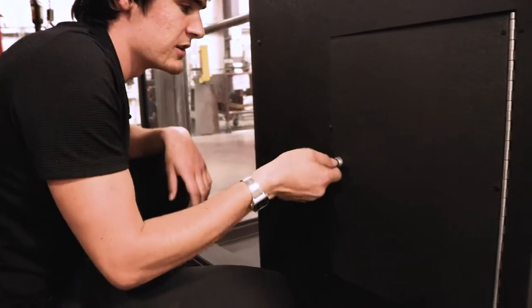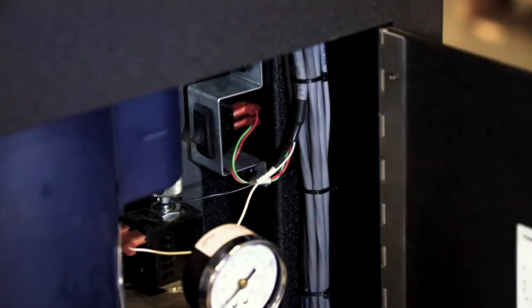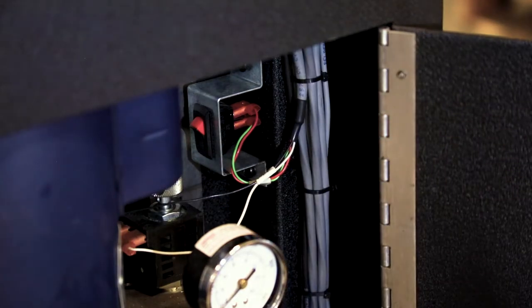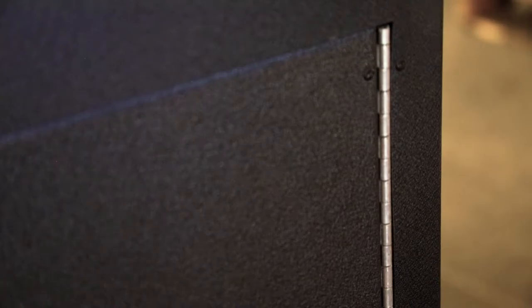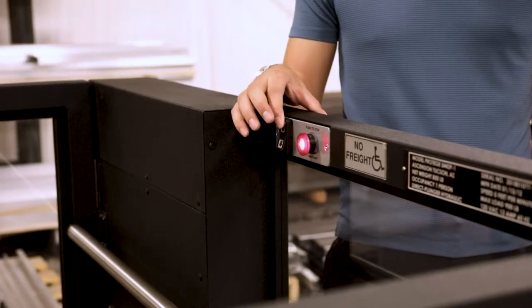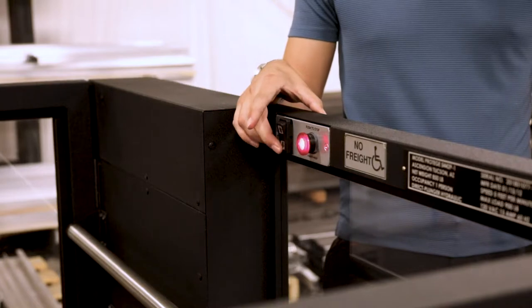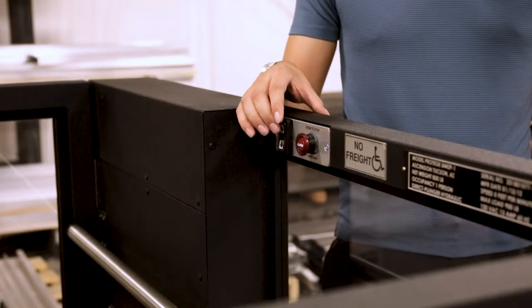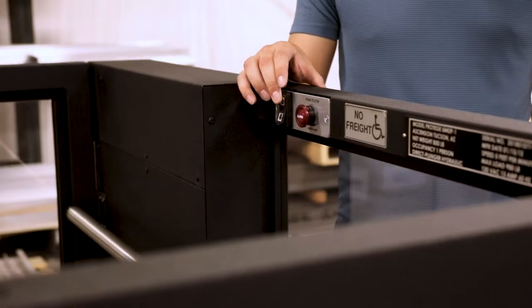Next, ensure that the on-off switch behind the locked access panel is in the on position. This allows for power to be supplied to the lift's electrical controller. Push and reset the red emergency stop button to ensure that it is not actuated. The lift will not run up or down while the switch is pressed.